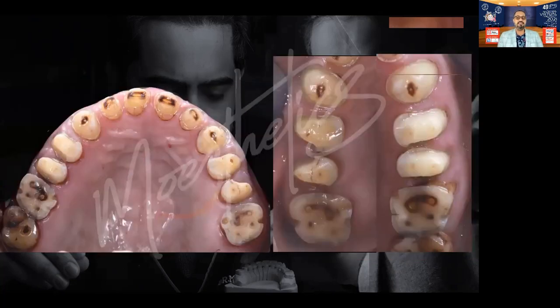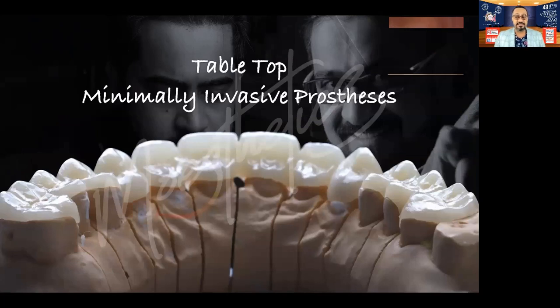These were all the mandibular preparations and all the maxillary preparations. Again, no endodontic treatment was done. Minimalistic preparations — barely a 0.5 millimeter deep chamfer margin everywhere. Proximal contacts were opened where needed because this patient had some proximal caries. Posteriors were bare occlusal reductions — classic overlay preps. Just the occlusal domes in porcelain, because that's where the patient bites and where the patient has majorly lost tooth material.